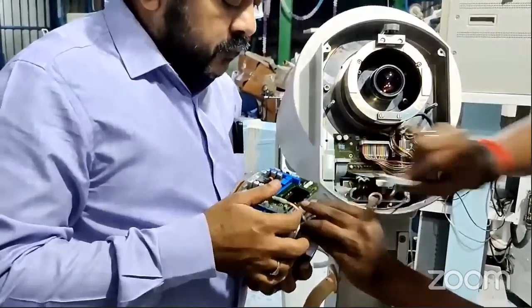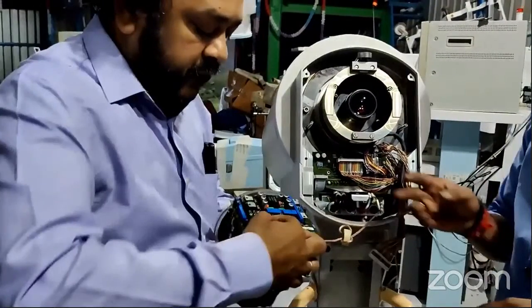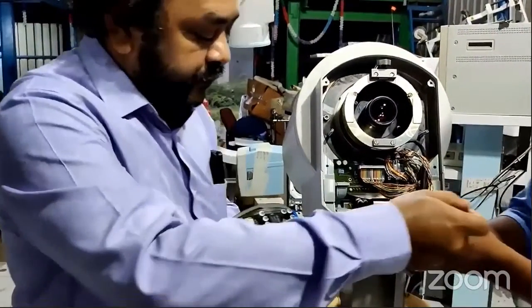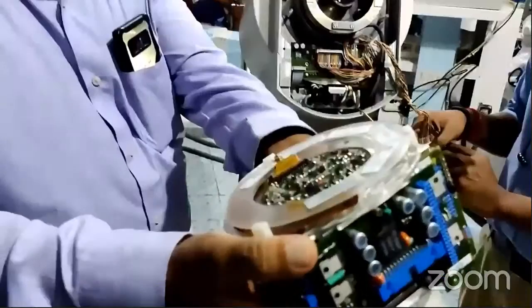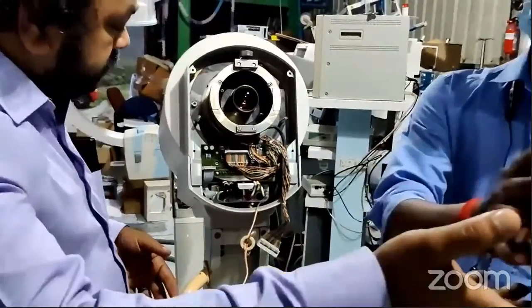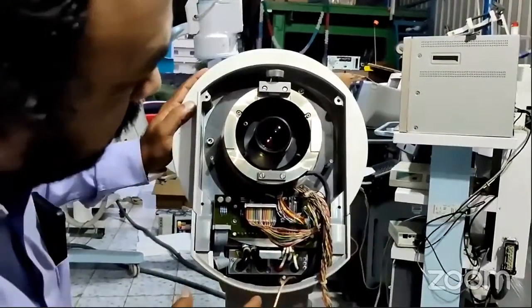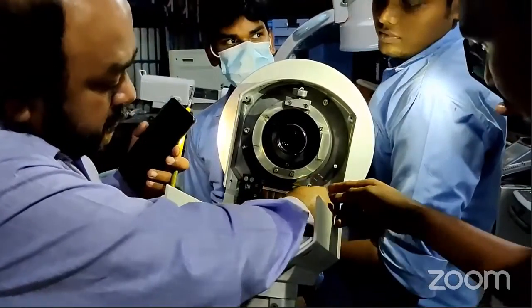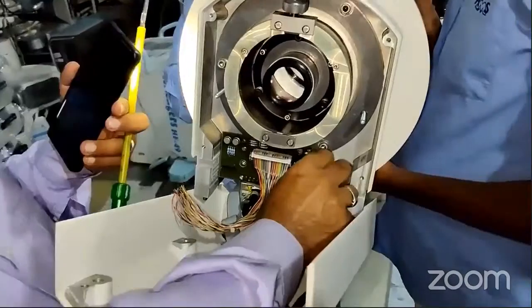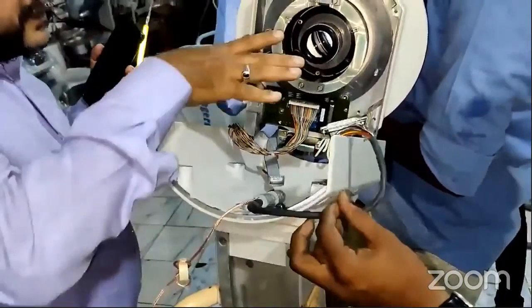So only one connector, and this is the video cable. So now I separated the camera. Okay. So now I am removing some cable from the C. Okay, isolated. So now the tube is isolated from the C.